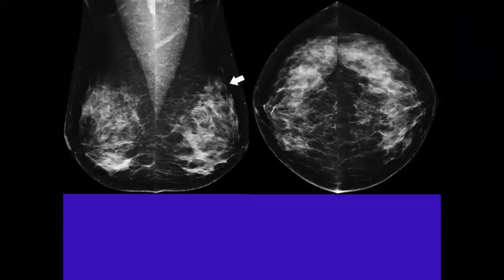Okay. Any other volunteer taking this case? Quickly. There is an arrow. You have an arrow. And this lesson, or this session, is talking about asymmetry, so it will be easier. Is this arrow pointing to a mass? Abir, is it pointing to a mass? I know it's pointing to an area of asymmetry.